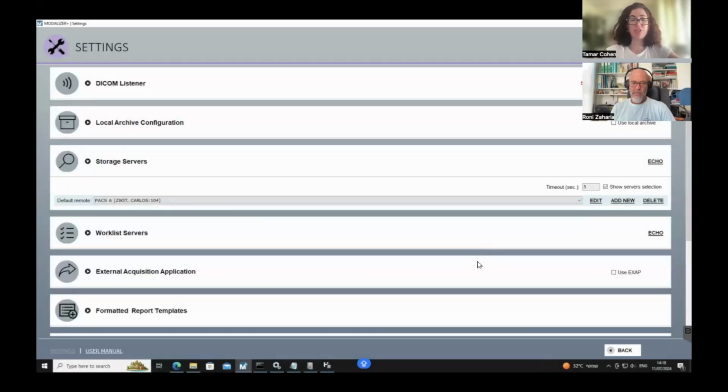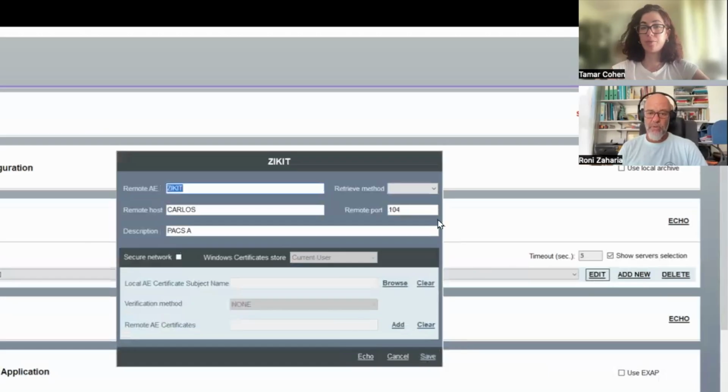So now we've established this connection. I was wondering if there are some kinds of errors that can happen along the way, maybe some questions our customers have from time to time about configuring this storage server. The most common is when you get "can't connect to the server." Let's simulate this: edit it and just change the port, put a different port. Then I'm going to go to echo.